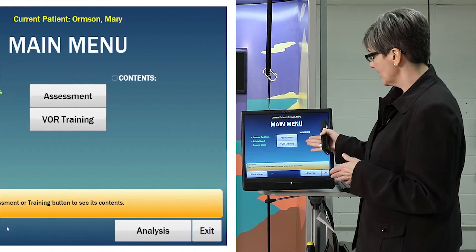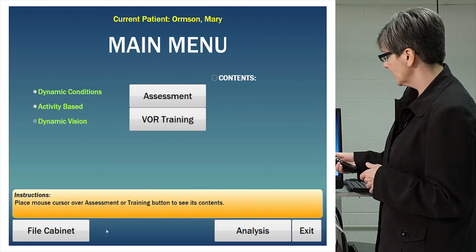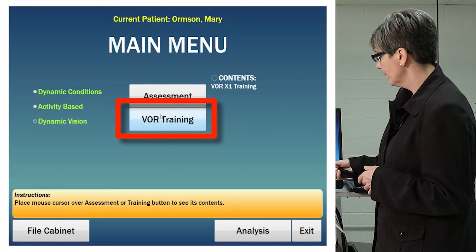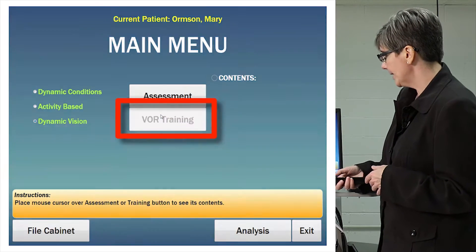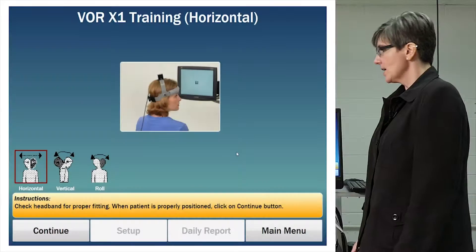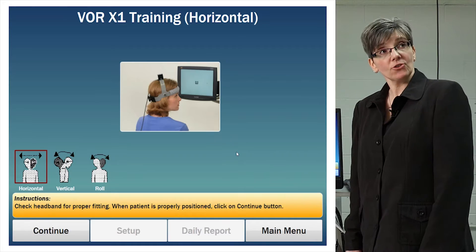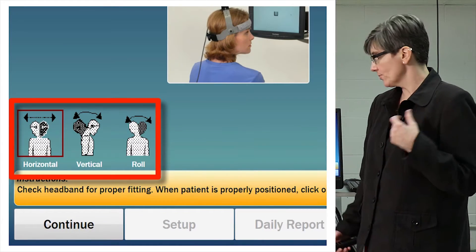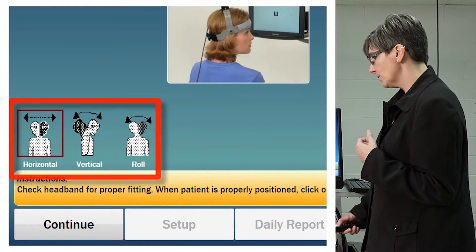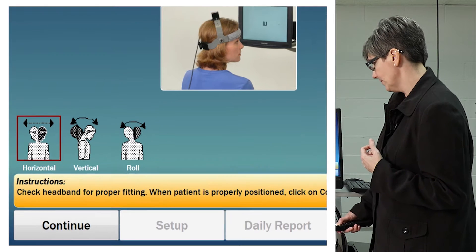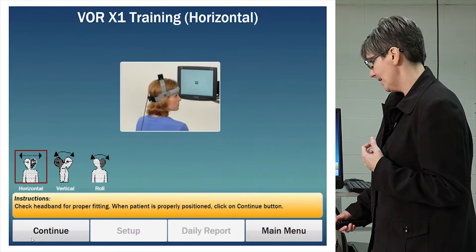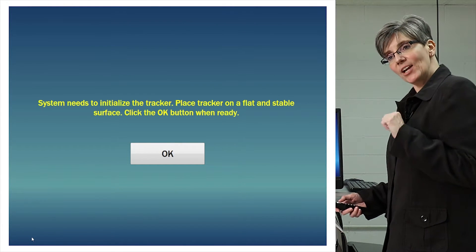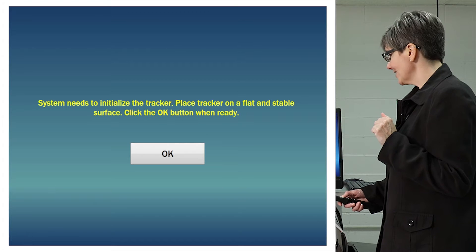I'm going to start here and click on the VOR training icon. In VOR training, I can train Mary in all three directions. We're going to stick with the horizontal for now and click on continue. Mary, don't move your head — we're going to initialize the tracker.